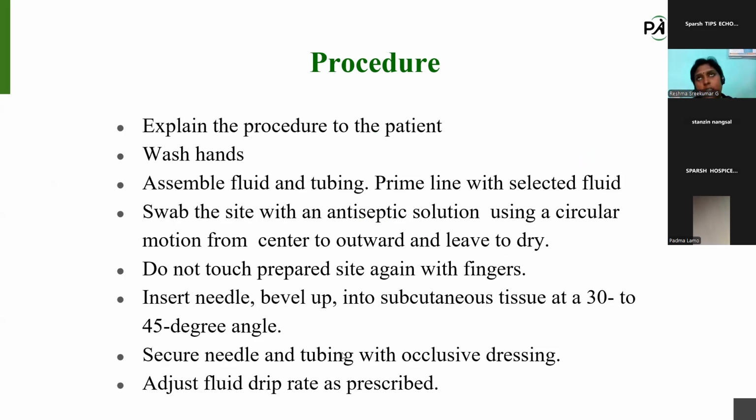Next is the procedure. It is very simple, like intravenous infusions. First, you should explain the procedure to the patient. It is very important to explain why you are choosing the subcutaneous route of administration for that patient. While explaining, we should explain the advantages also, and why we are choosing subcutaneous infusion for that patient.